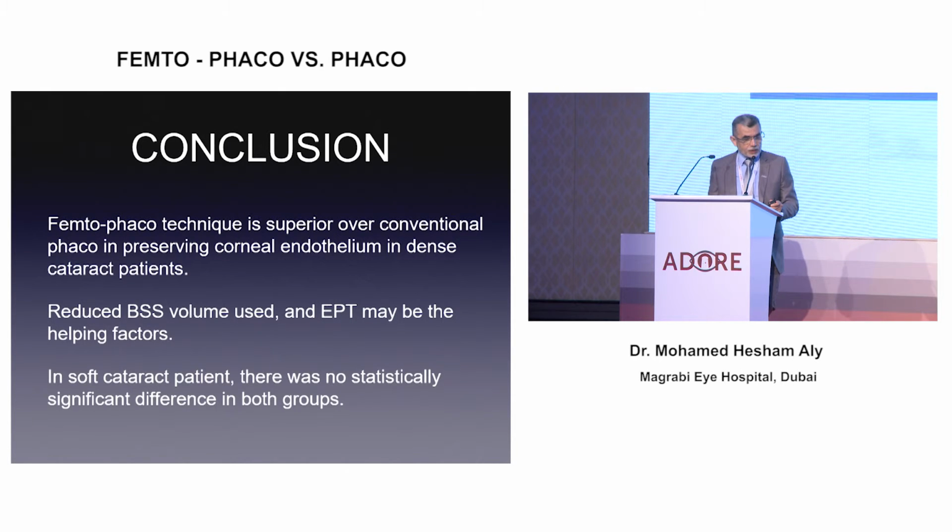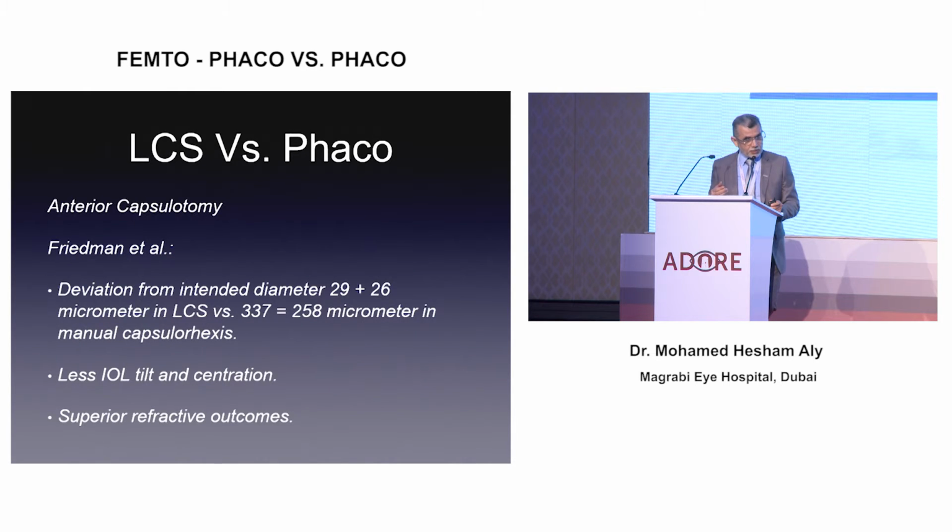As a conclusion, FEMTO phaco was superior over the conventional in corneal endothelial density, but not that much. Reduced BSS, not that much. But the phaco time was much less. We have lots of studies.